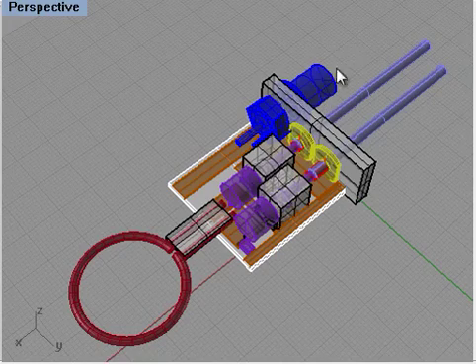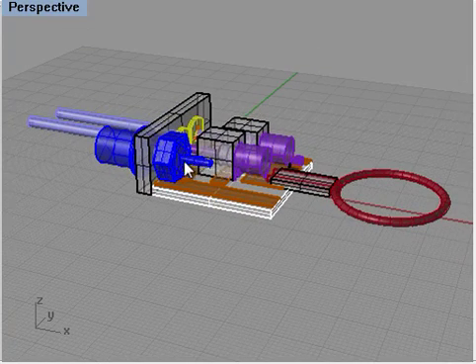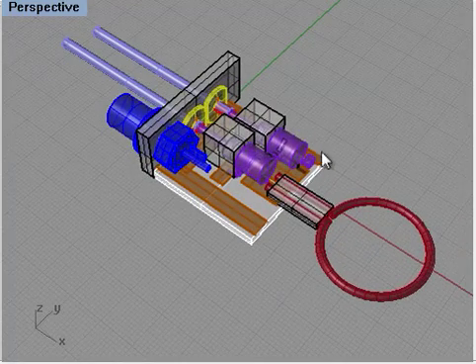Here is the BNC cable, which would come in here, and this eventually would be, although it's not shown here, soldered down. This little piece of this connector would have a wire soldered to a copper bus, so that would carry the power from the RF amplifier onto the circuit and eventually into the coil itself. So in our coil circuit diagram, this is L, the inductor. This is the capacitive matching network, and the coil actually has some resistance in it. So what we have here is our resonant RLC circuit.